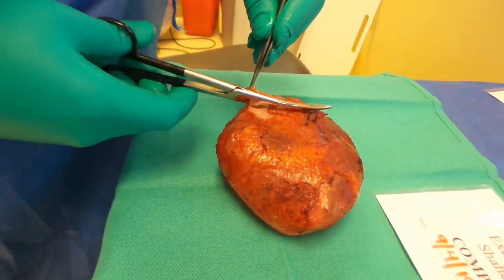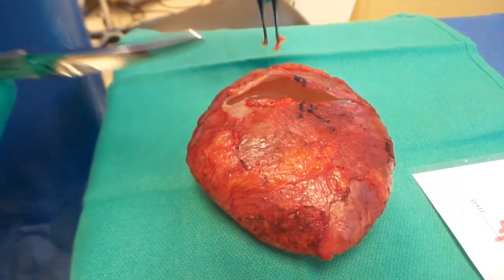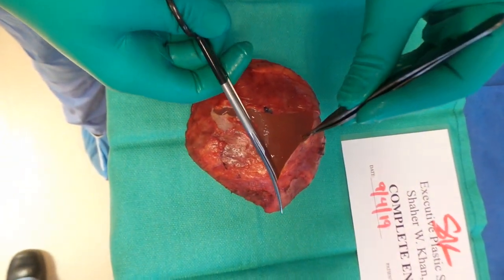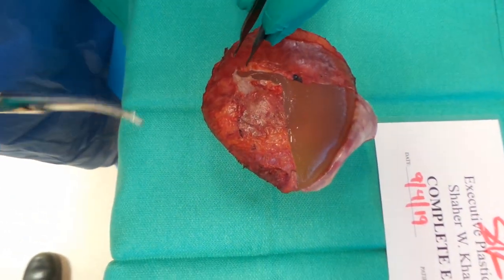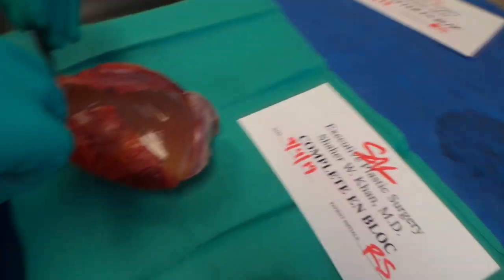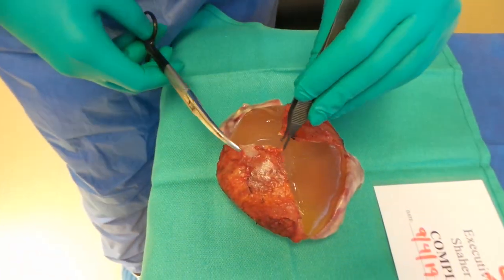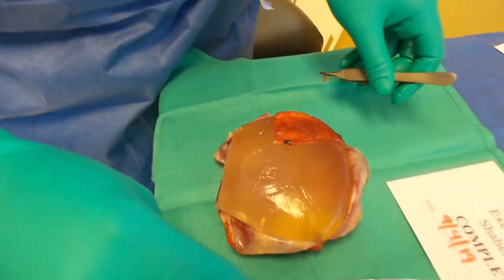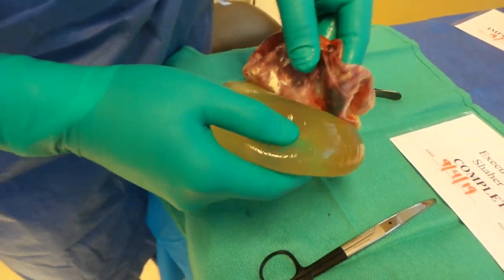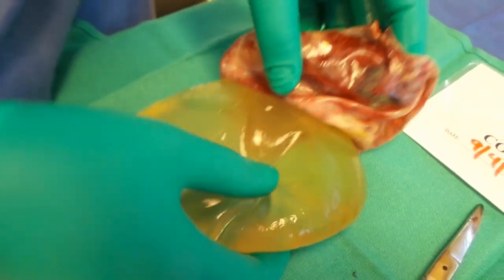For the first time, I'm opening this up. As you will see, you can actually hear it being cut. I'm going to cut it up into the four quadrants. You can actually hear the implant capsule right here — very thick and indurated, very abnormal capsule. As you will see for the first time as I'm removing it, it has actually had a leak. This was all contained, and these are abnormal particles that you see right here.